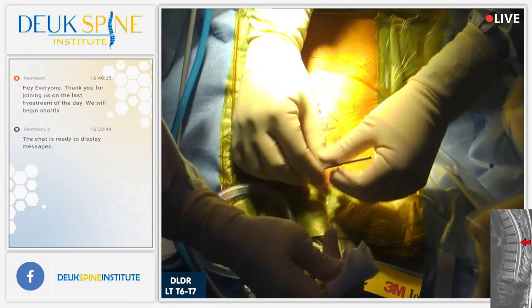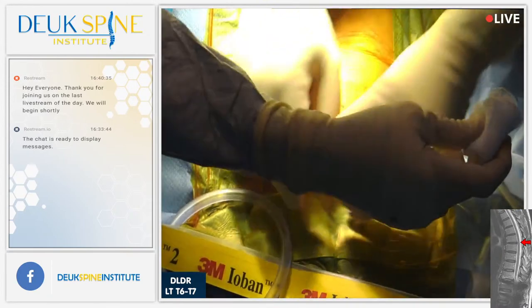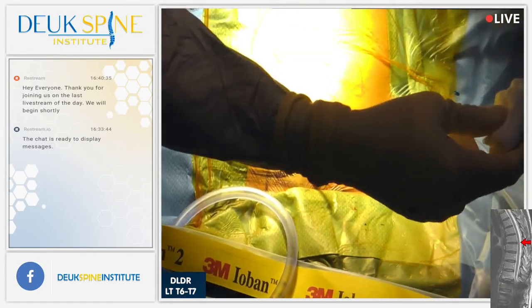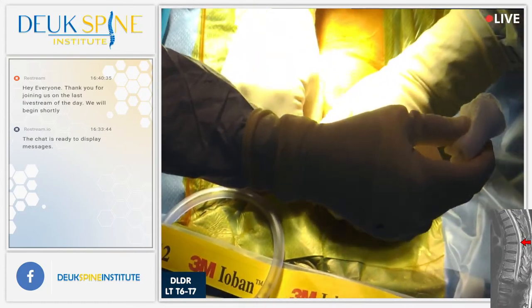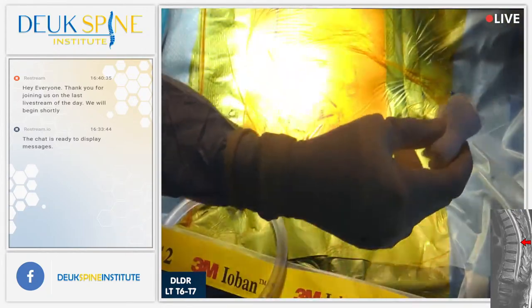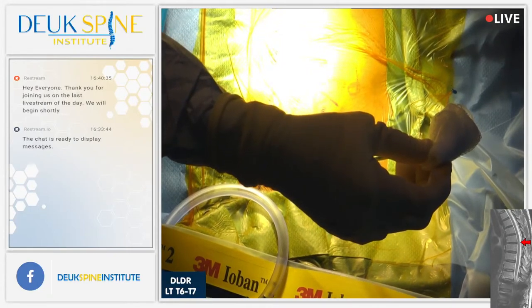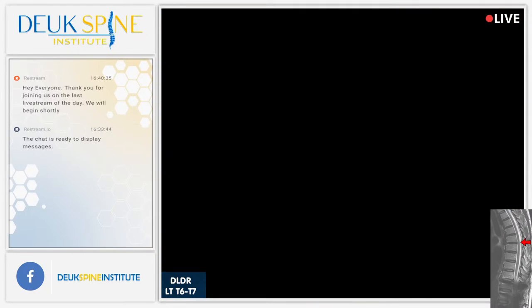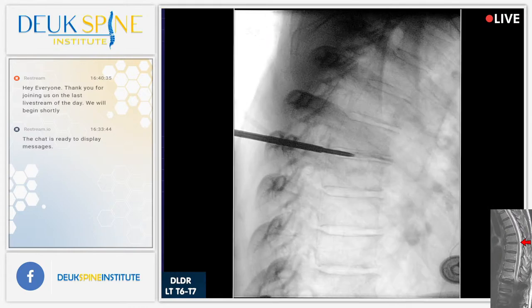You're doing great. Lay still. Shot. All right, hold on. So the tube is almost to the back of the disc. Shot. Again, we're coming transforaminal. Everything okay, guys? All right. Let me see. Shot. All right, so the tube is almost to the back of the disc. Let's get her a little bit deeper, if you can. Hold it. Shot. That's good.